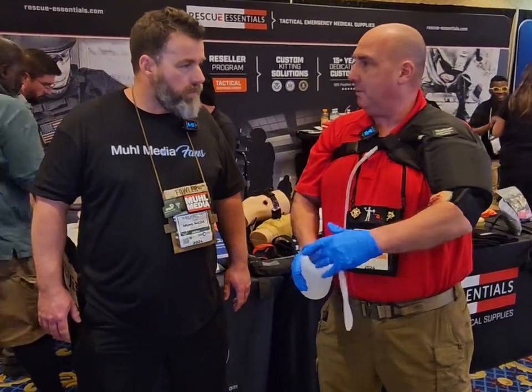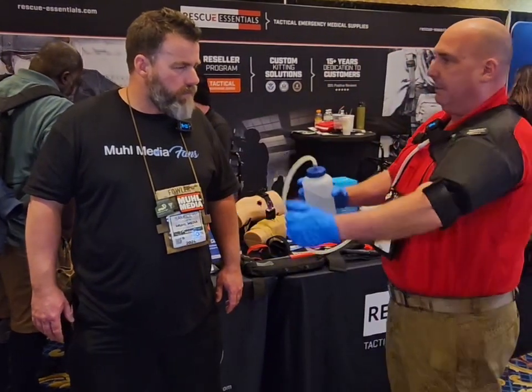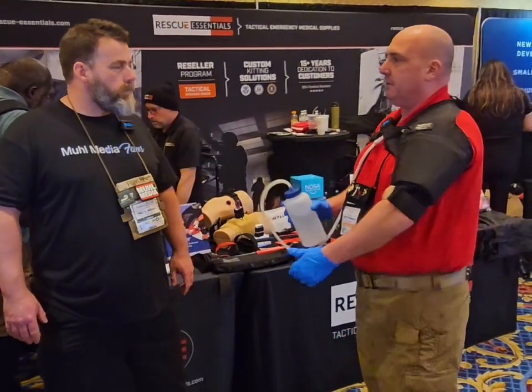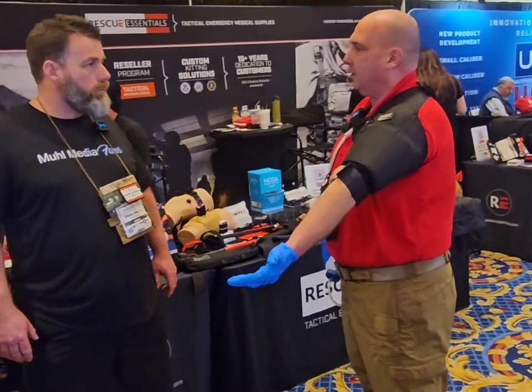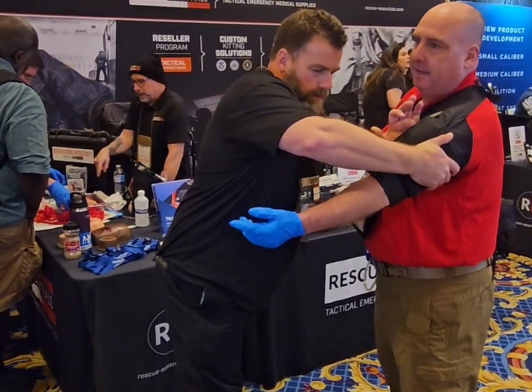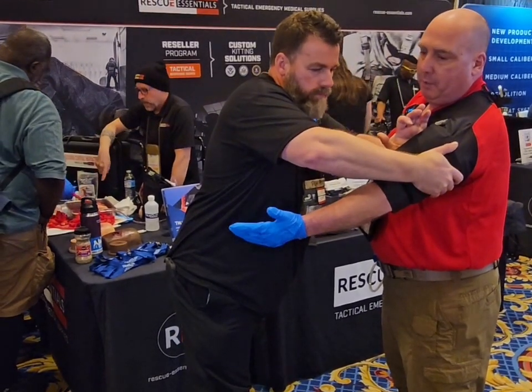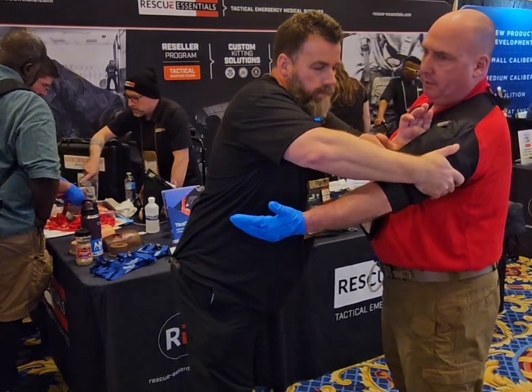One of the demos I like to do with students is I'll have two people there. I'll say, 'Hey Sam, you don't have a tourniquet and I'm bleeding here — you're going to grab a cop there.' Then I'll have another person and say, 'Hey, you have a tourniquet and you need to get it on me. What are you going to do?' There's one or two ways they're going to do it — the right way and the wrong way.